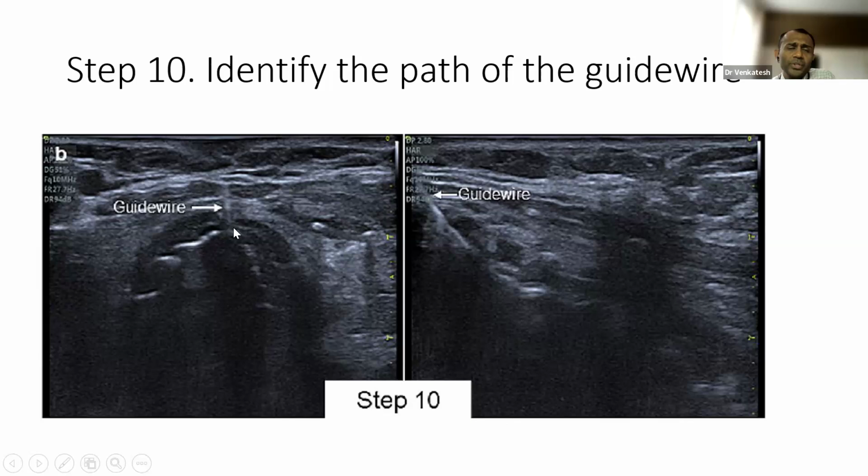First, you adequately sedate and paralyze the patient and give a good position. You have screened already with your ultrasound. Then you have already positioned your probe in the transverse axis and you have entered the needle. Once the needle is inside, you can use the cannula.